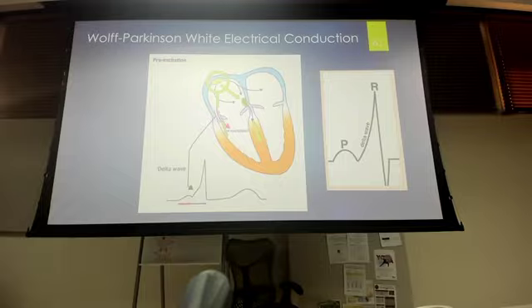And because we are having depolarization of the right ventricle and the left ventricle at different rates, depending on where that accessory highway is located, the main area we're going to see that is in the upstroke or upswing of our R wave. So our PR interval is going to be shorter than normal, because we've got depolarization in the ventricles occurring earlier than what we'd expect. Even though some of those depolarizations are going through the AV node, we've got depolarization of those ventricles earlier.